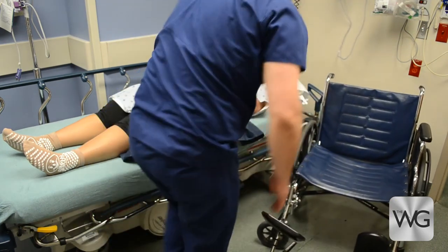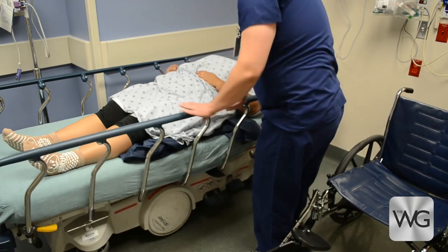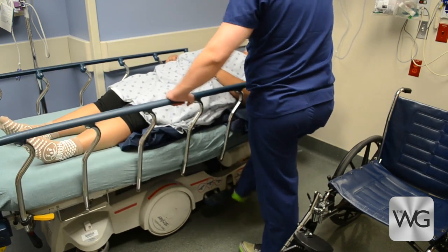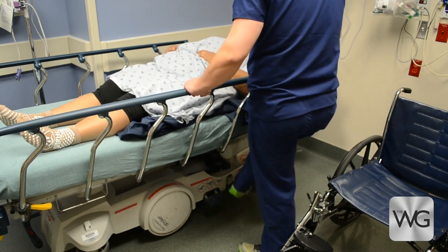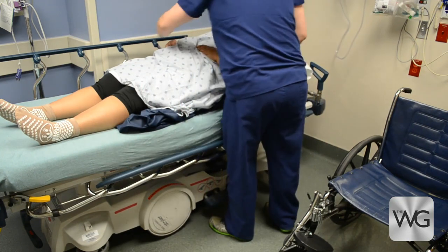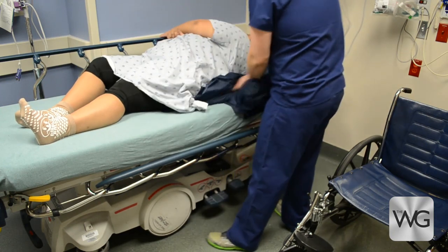Once on the stretcher, the patient is instructed to continue scooting back, to bring lower extremities into the bed, and to return to a supine or sideline position. The caregiver will bring the bed to a comfortable working level, finish positioning the patient, and remove the slide sheet. Remember, we never leave slide sheets under an unattended patient.